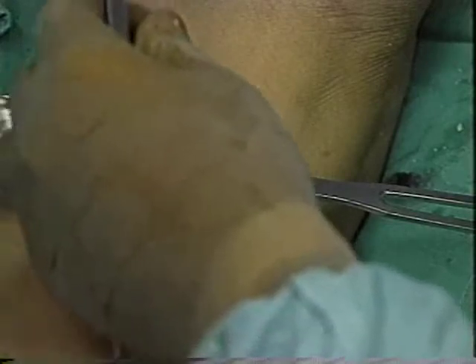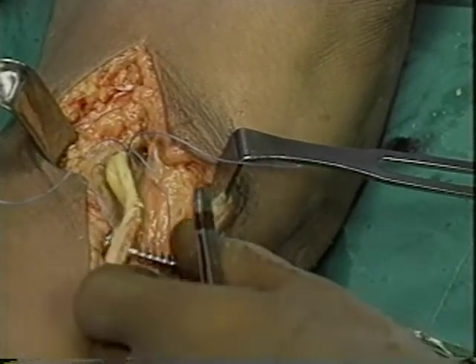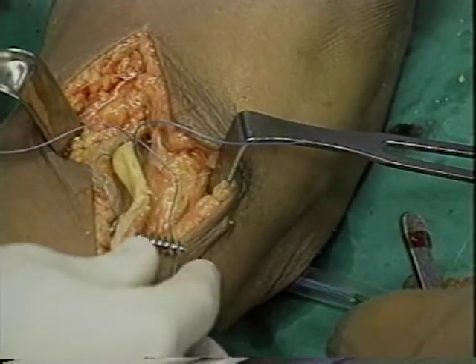The previously prepared graft is now passed through the graft passer and pulled to the anterior aspect of the knee joint through the femoral drill hole.